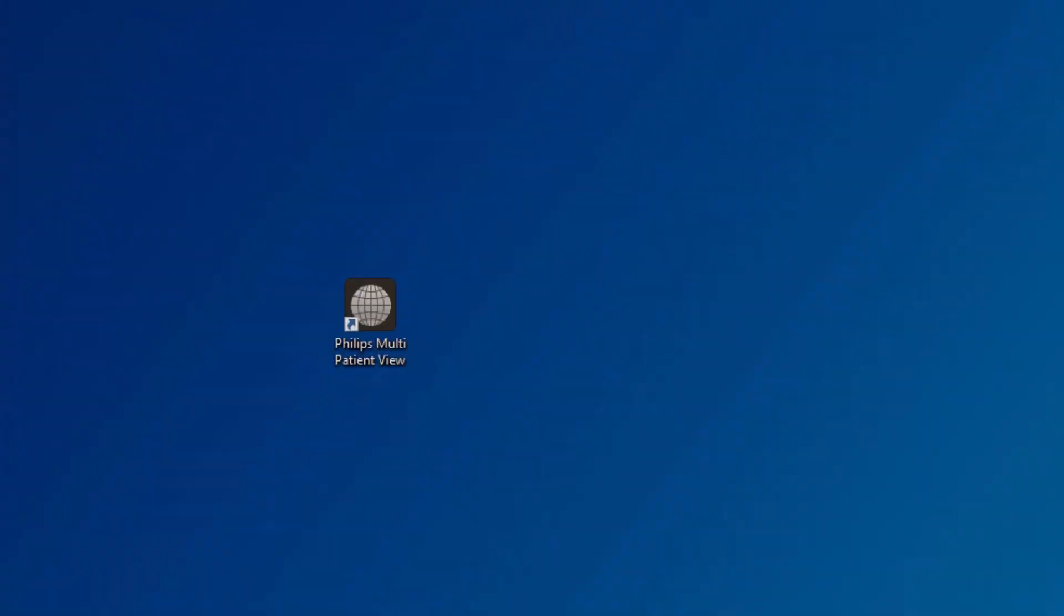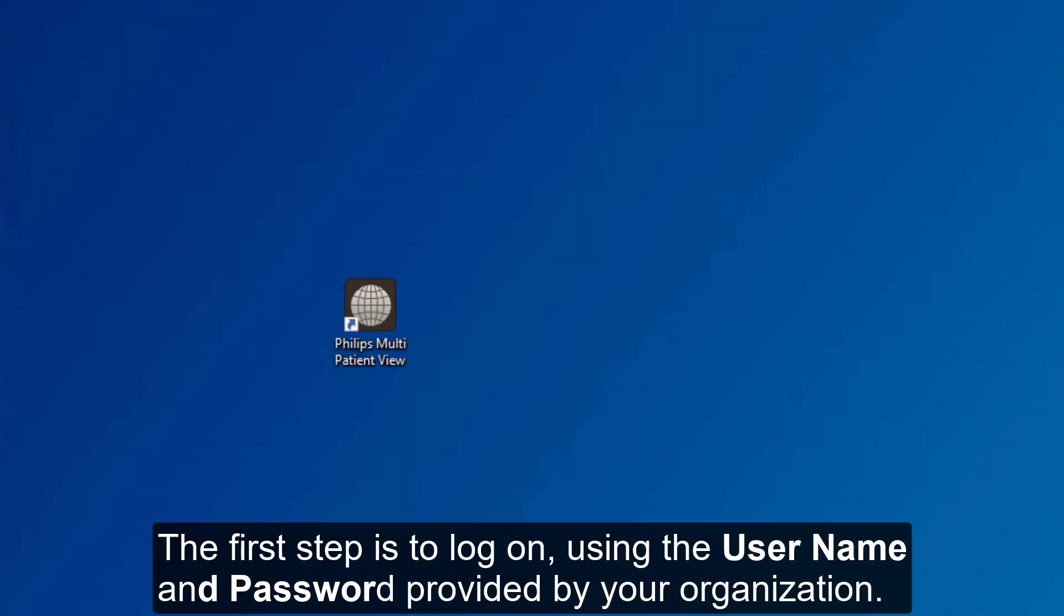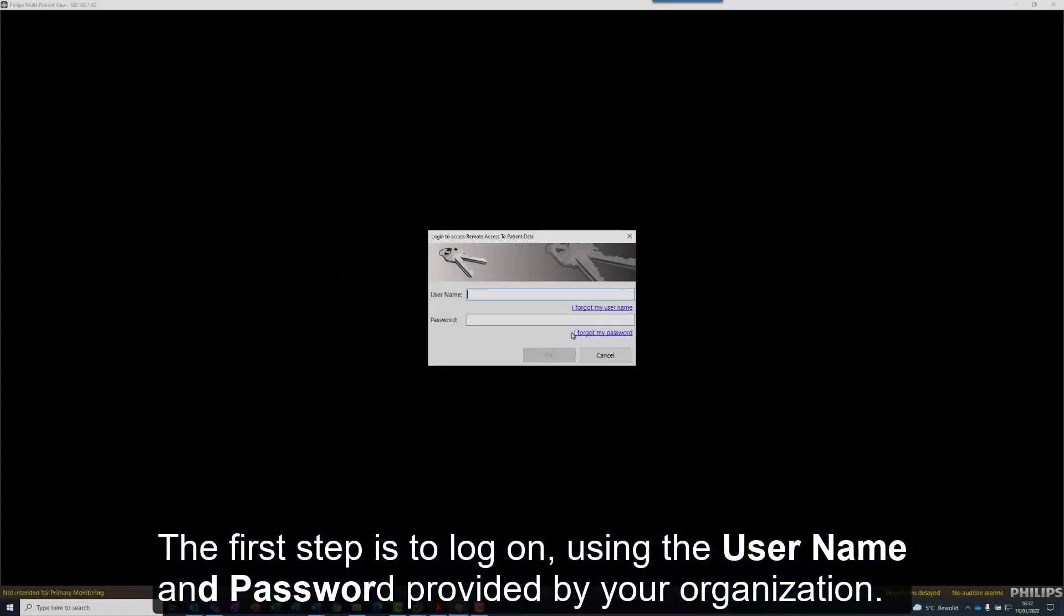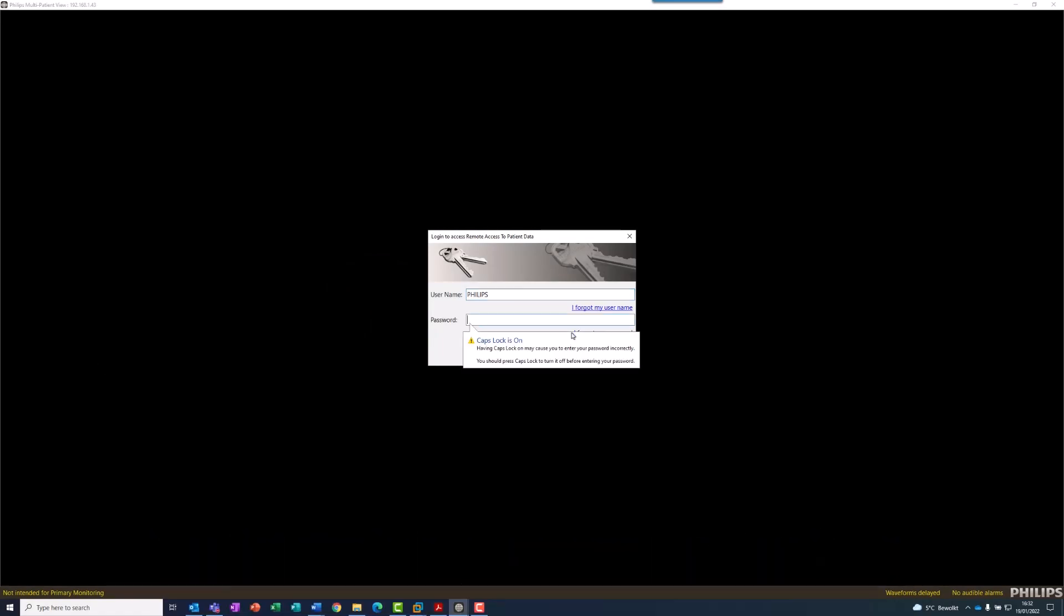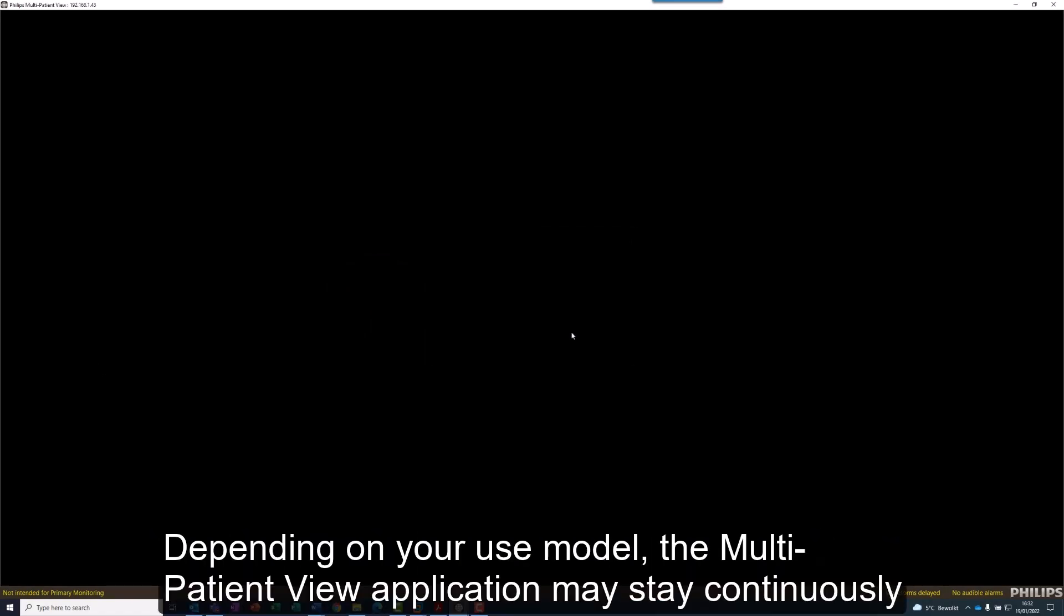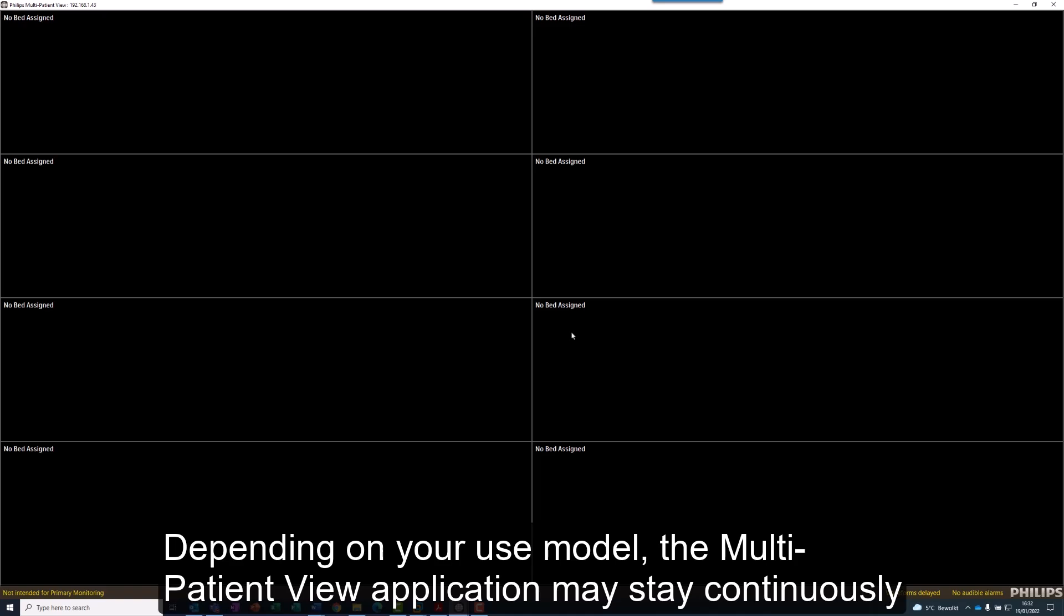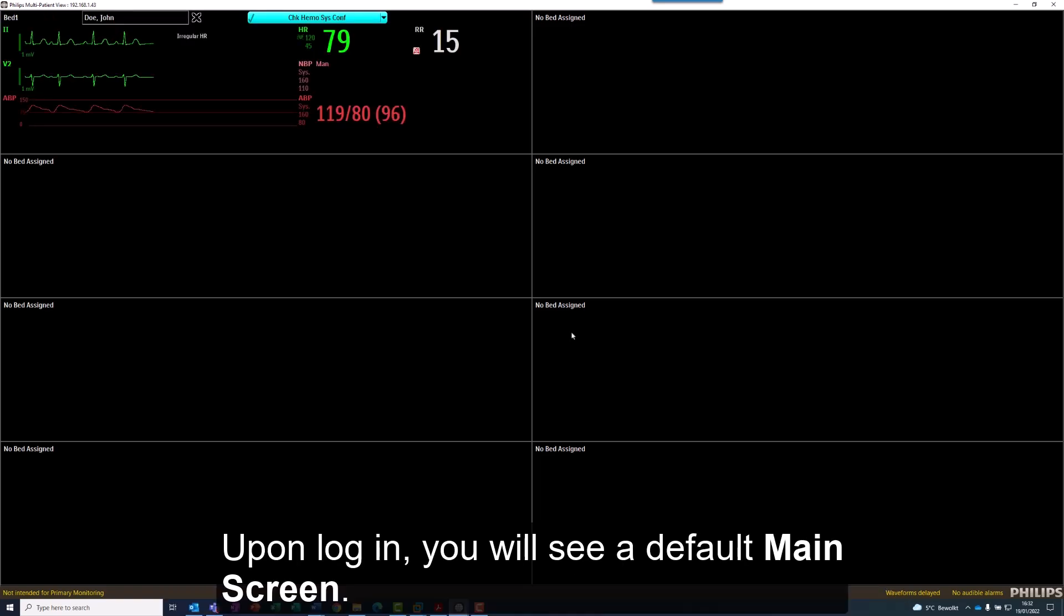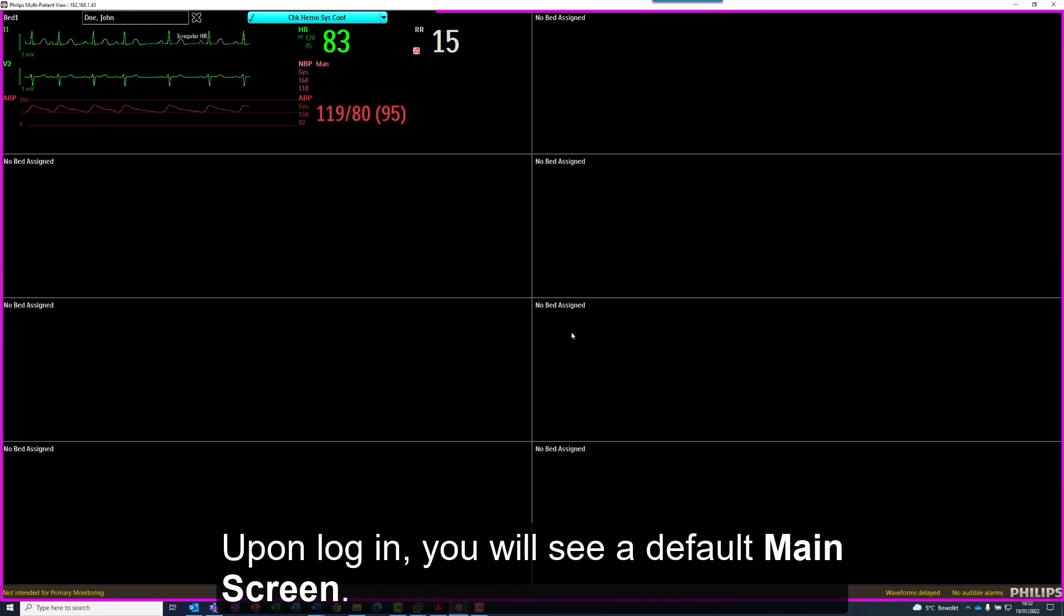The first step is to log on, using the username and password provided by your organization. Depending on your use model, the Multi Patient View application may stay continuously logged in. Upon login, you will see a default main screen.